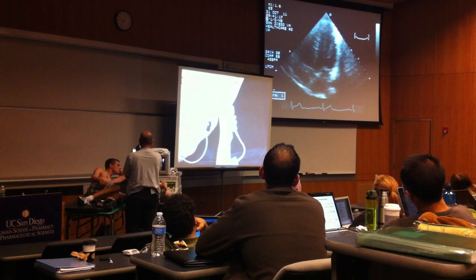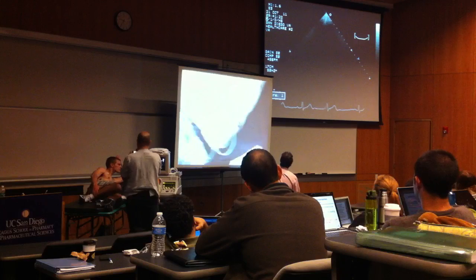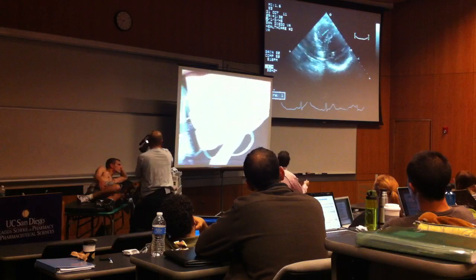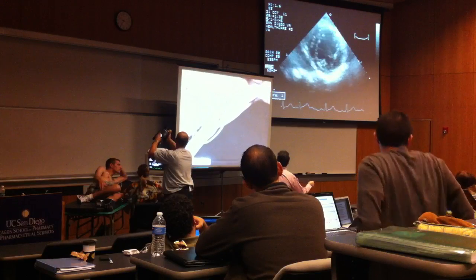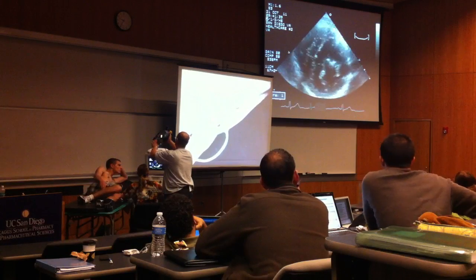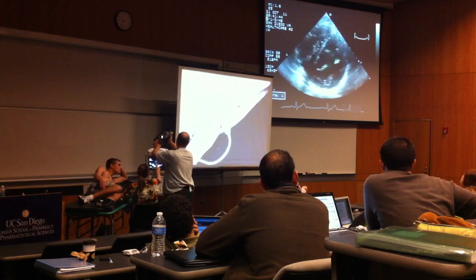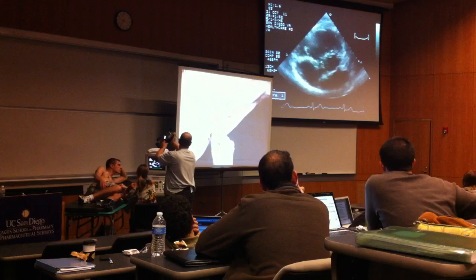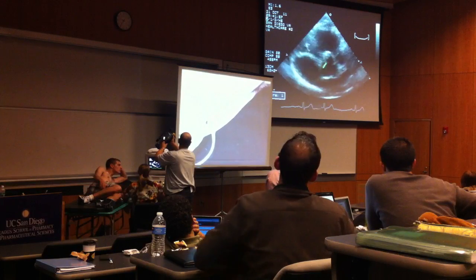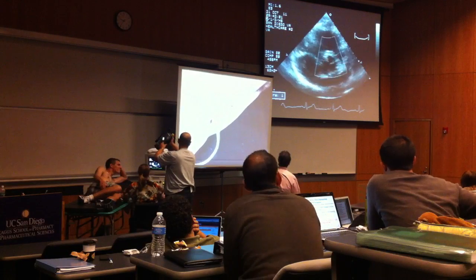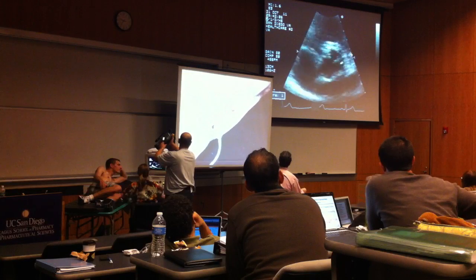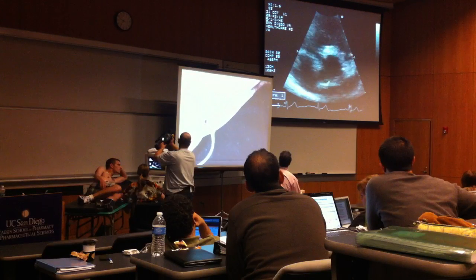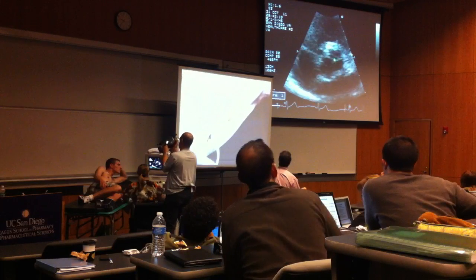Let's get a short-axis view to look at the aortic valve. Just by changing the transducer position, we can get a different view — this is now a bread-loaf slice of the left ventricle with the mitral valve in the center. Angling up, here's the papillary muscle and other papillary muscle parts of the mitral valve apparatus. Here's the aortic valve, where we can see that our subject has three normal leaflets opening and closing, meeting right in the center. We can see those valve leaflets opening by a large area for the blood to get out, and then they close and meet right in the center.